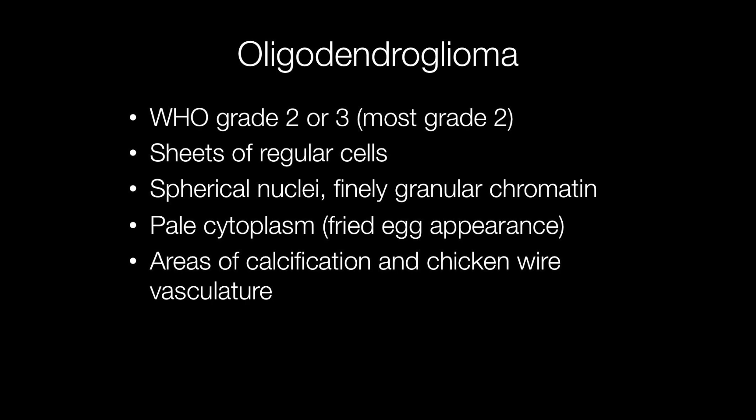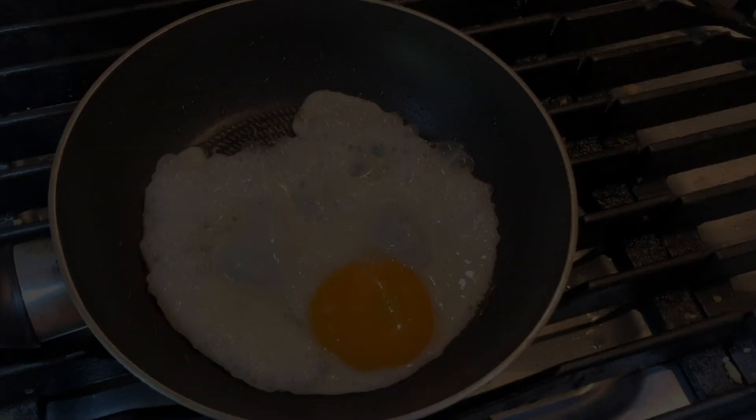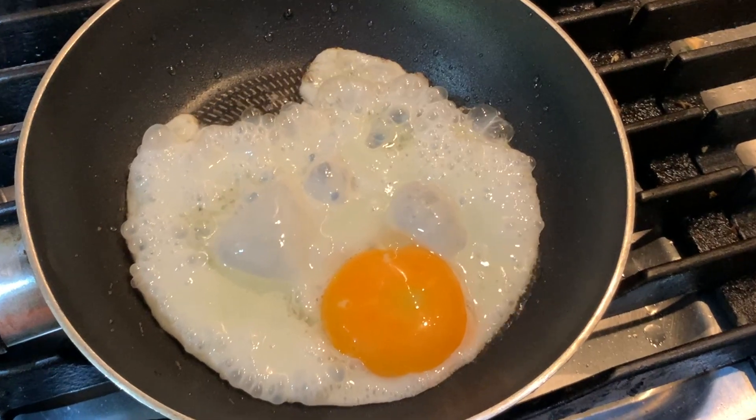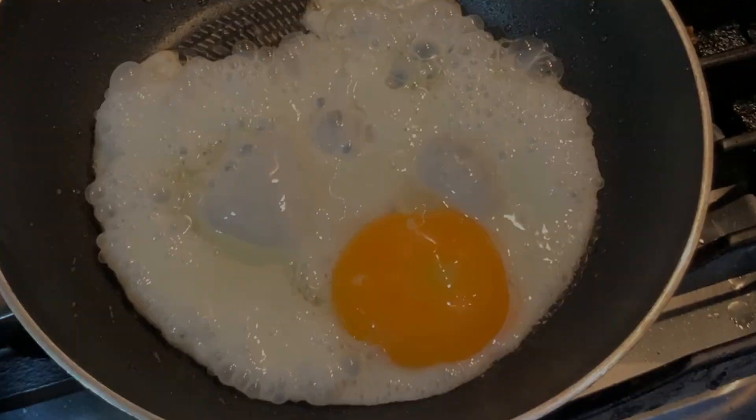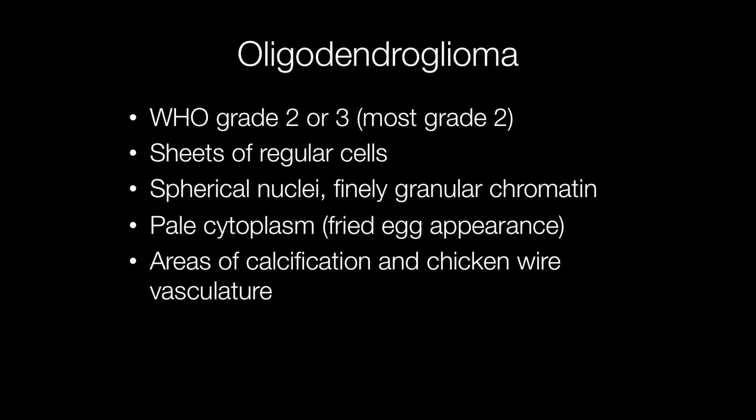Most oligodendrogliomas are WHO grade 2, and the grade 2 tumours are composed of sheets of regular cells with spherical nuclei with finely granular chromatin and infrequent mitotic figures. The cytoplasm is pale, resulting in a fried egg appearance. There may be areas of microcalcification, and the vasculature may have a chicken wire appearance.